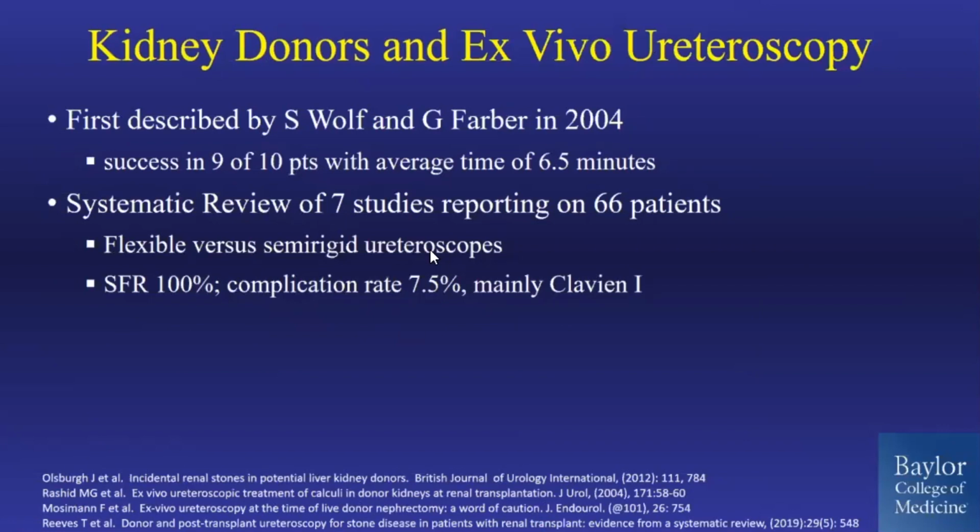Stuart Wolf and Gary Faerber described that first back in Michigan in the early 2000s, and they had really good success with it, and it didn't take a lot of time on that back table. That's been our experience as well. And this was a pretty robust systematic review looking at patients who had undergone this procedure, and generally it's quite successful. The stone-free rate can be high and the complication rates can be low.